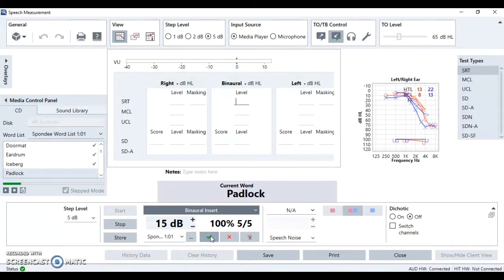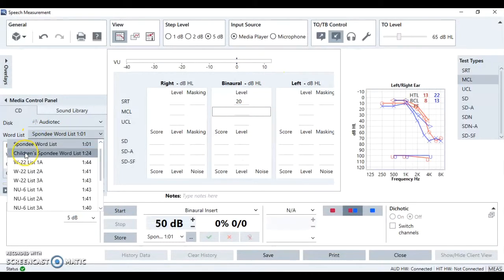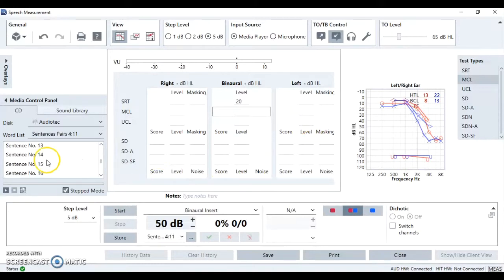Now, a person with good hearing can get down to 10 or even 5 decibels on the speech reception threshold. Average speech is 35 to 55 decibels. So quite often we see people who have hearing losses that they're only getting down to 25 decibels or even 35 or even 45 decibels, which means at a normal volume or at 25 decibels, when somebody's talking quietly, they're not even understanding half of those words.